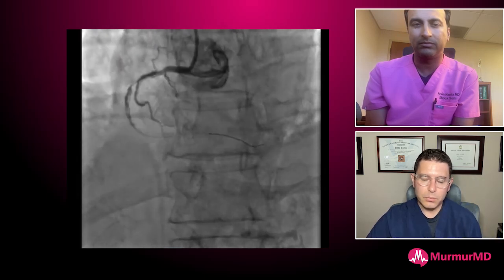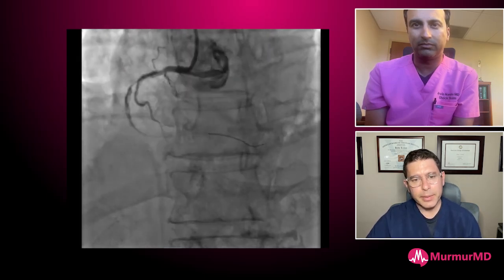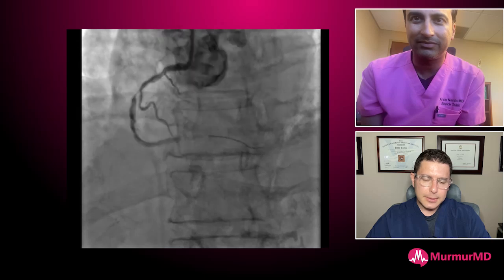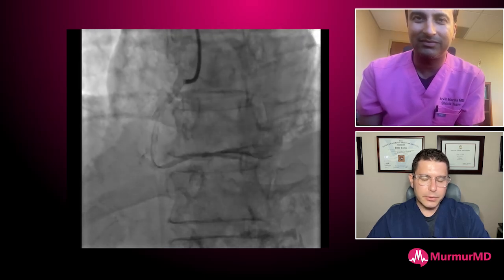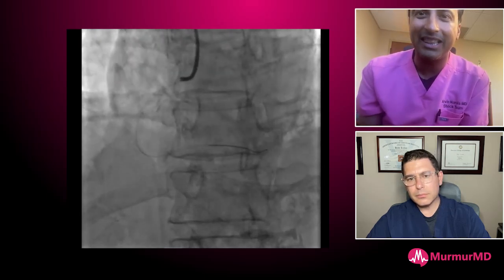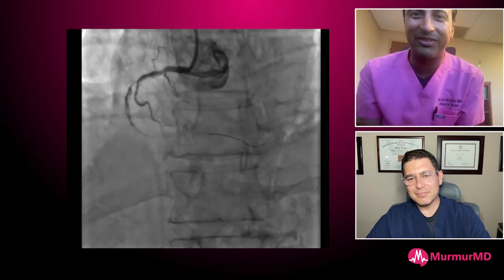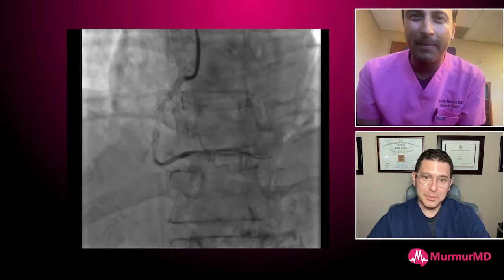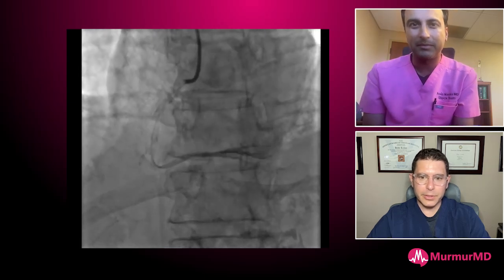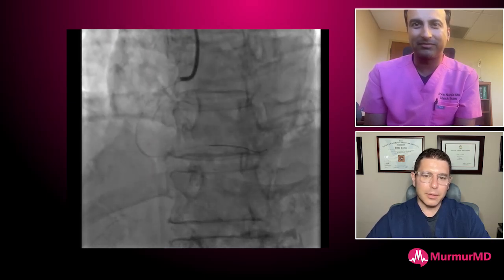The only downside in someone hemodynamically unstable or throwing VTs is the duration of the angioplasty time. But in a STEMI the vessel was already occluded, so that's less of a concern. Looking at the RCA, I think of this as the cath lab TAPSE — the RCA runs in the AV groove and there's good motion there, so it doesn't look like RV failure. This lesion was probably 99% before it occluded, and on the left shots you can see faint collateralization.